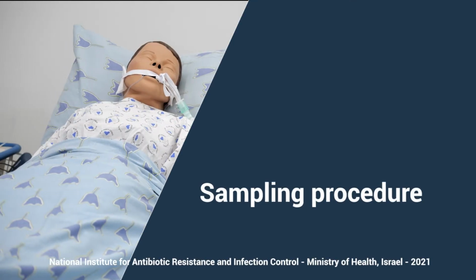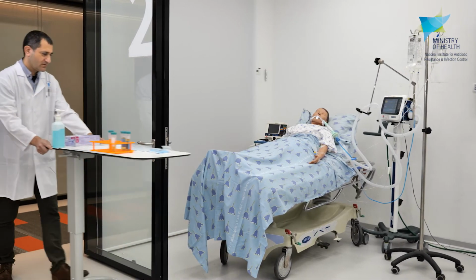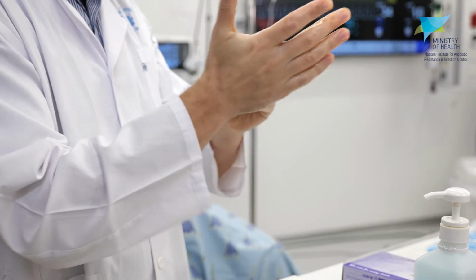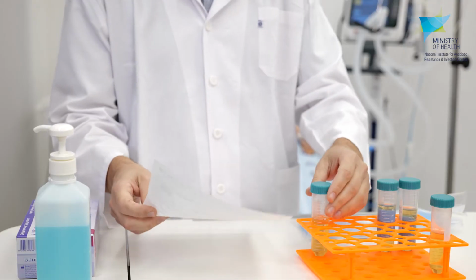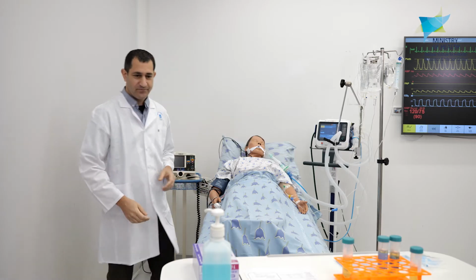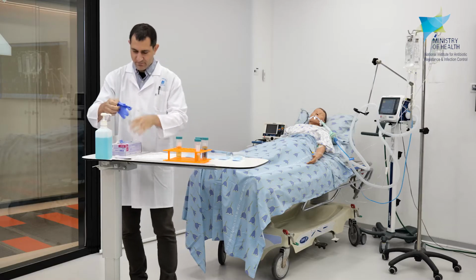Sampling procedure. The sampling procedure is performed using aseptic technique. Before and after sampling, we will perform hand hygiene and use protective measures in accordance with standard precautions and isolation procedures. Verify patient details. In order to increase the sensitivity of the test to detect CRAB, sampling should be performed before bathing the patient. Disinfect hands and put on gloves.